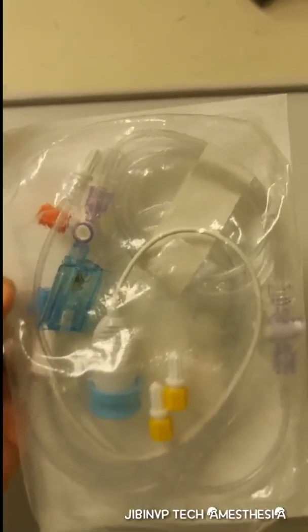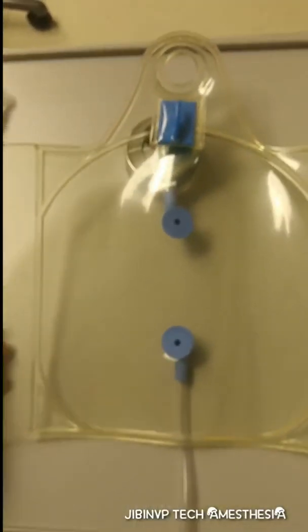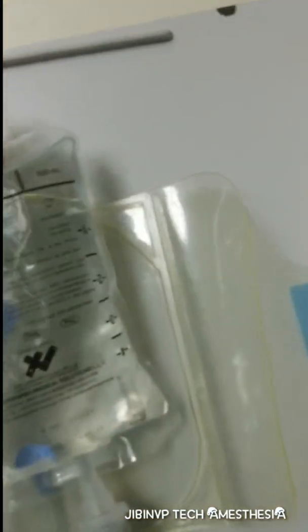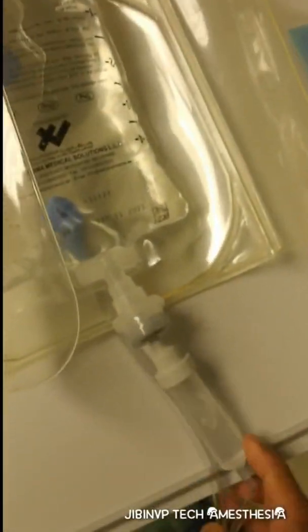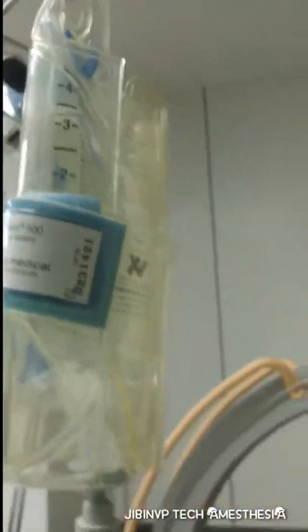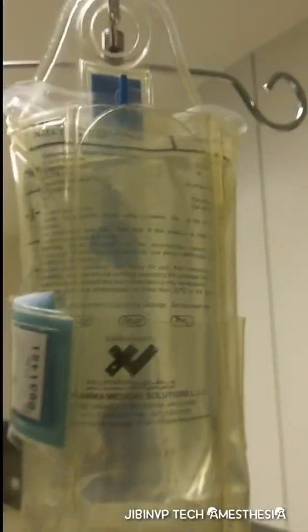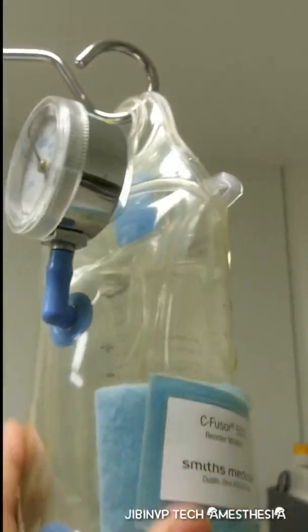Now we can open this packet and prime it with normal saline. First we can attach and connect, and we can see the pressure is around 300.